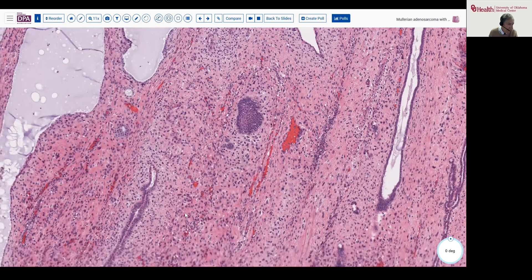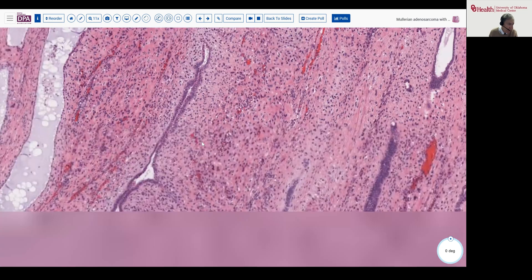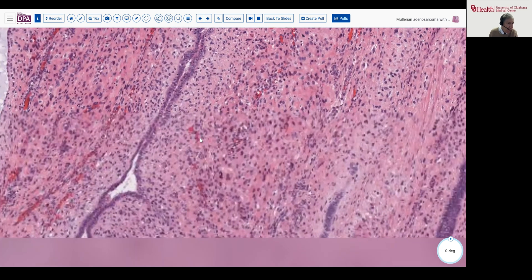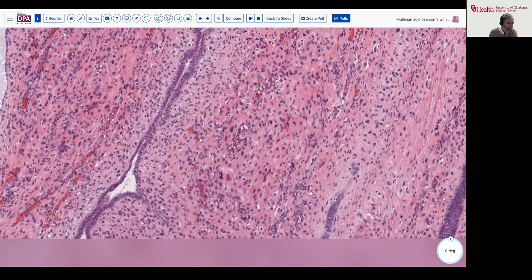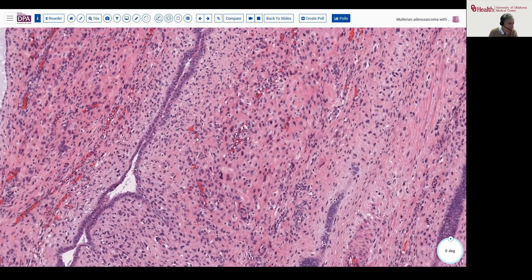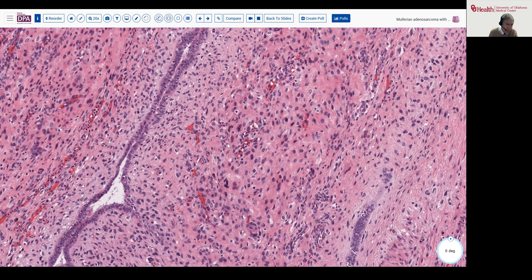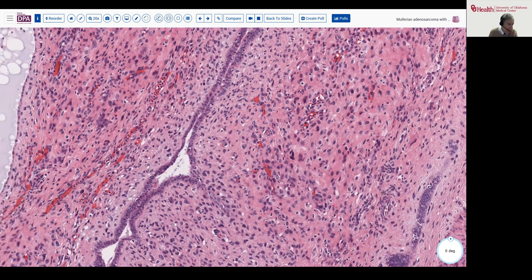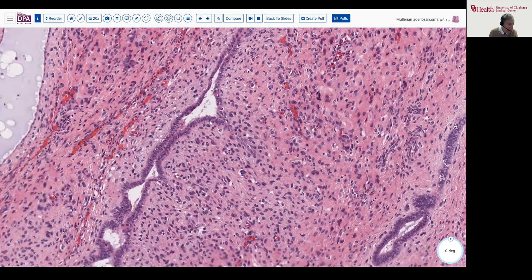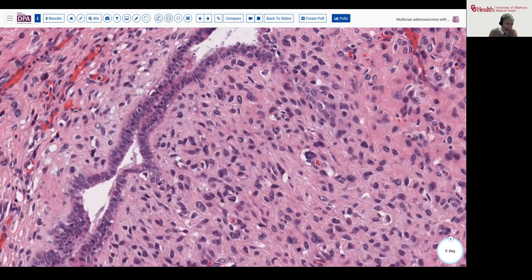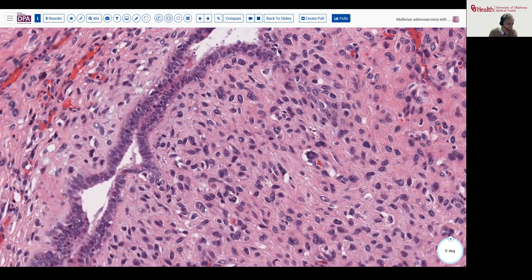Consideration for adenosarcoma, low-grade in this sort of an appearance, the differential being with a typical endometrial polyp or possibly an adenomyoma or something of that sort. Here we can see more of this atypia — fairly mild, but certainly not the usual stromal cells, some binucleation, some horseshoe-shaped cells, some nuclear enlargement.